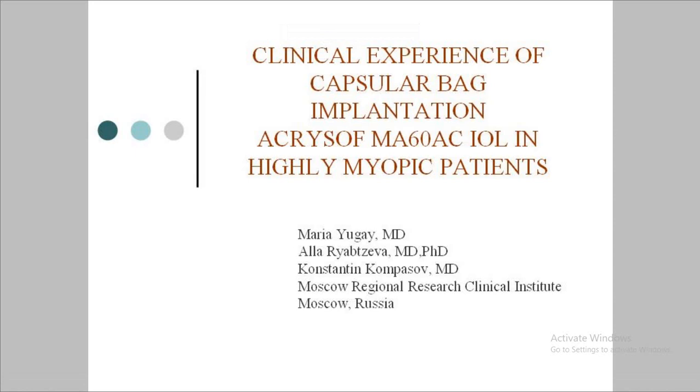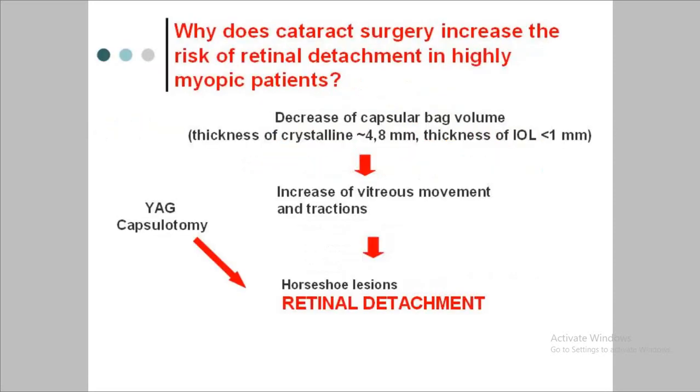Dear Chairman, dear colleagues, first I want to apologize that my topic is not closely connected with IOL power calculation. It is how we try to prevent the complications of surgery of highly myopic patients. The most severe complication of cataract surgery in highly myopic patients is retinal detachment. It can occur at any time after surgery, even if prophylactic argon laser coagulation was performed. Why does cataract surgery increase the risk of retinal detachment in highly myopic patients?